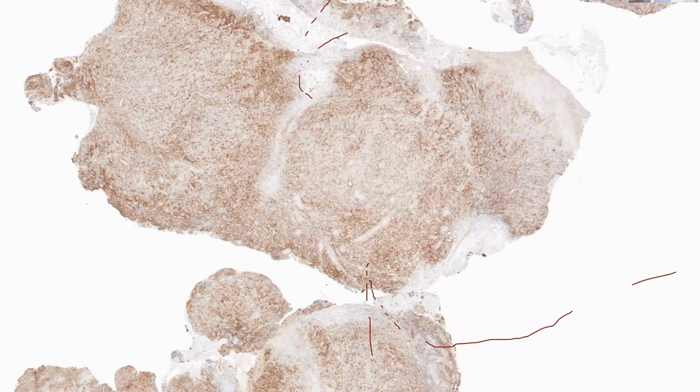It was in a young patient. And an added point is that PD-L1 expression is very strong in such cases, which is an added desirable criterion to diagnose this entity.